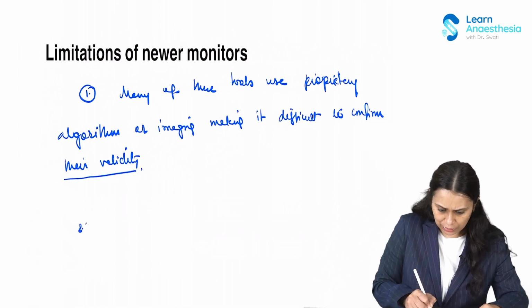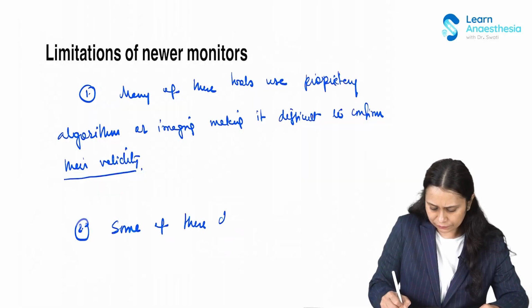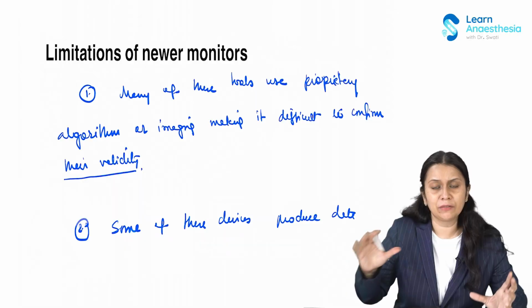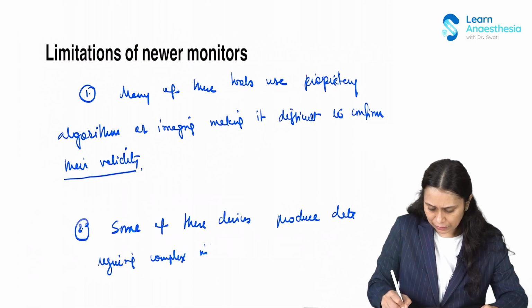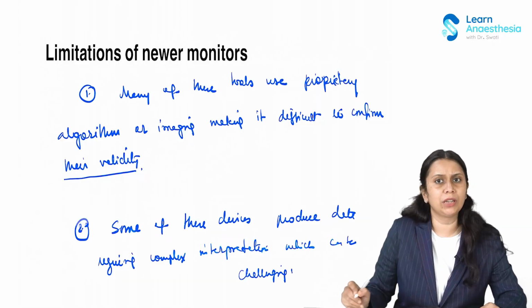Then the second issue was that some of these devices produce data requiring complex interpretation, which requires an expert with that monitor to interpret the data. This can be challenging if the people who are monitoring are not properly trained.